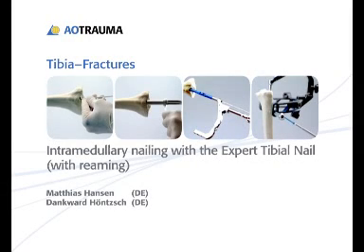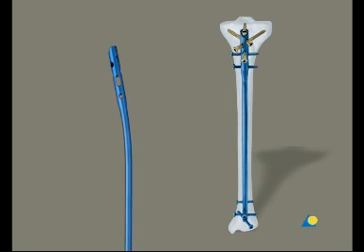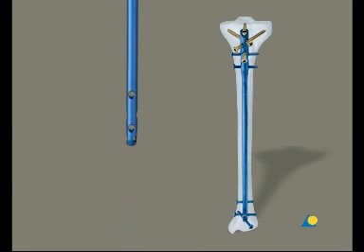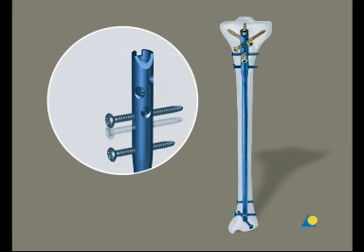Intramedullary nailing with the expert tibial nail with reaming. The expert tibial nail has a new anatomic bend that makes nail insertion and extraction easier. The cannulated version enables nail insertion over a guide wire. There are several possibilities for proximal locking. Three of these locking options use cancellous bone locking screws to improve stabilization of the proximal fragment.